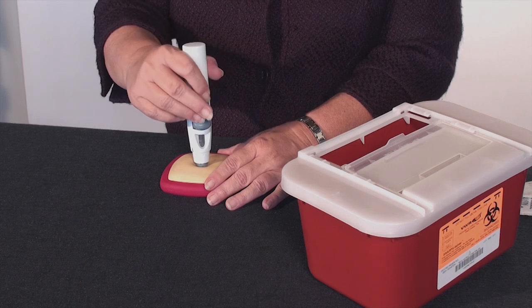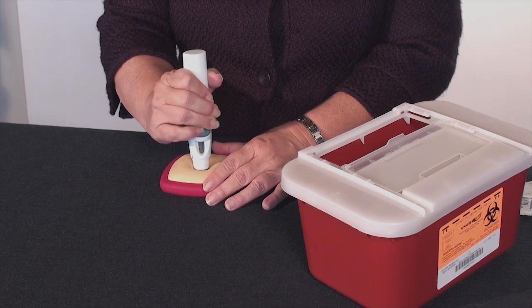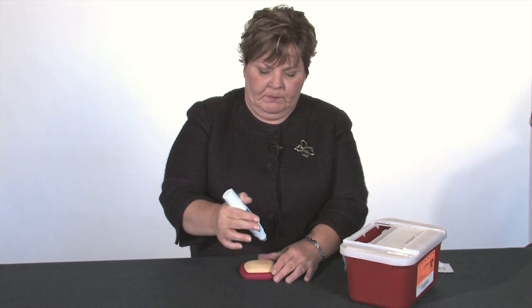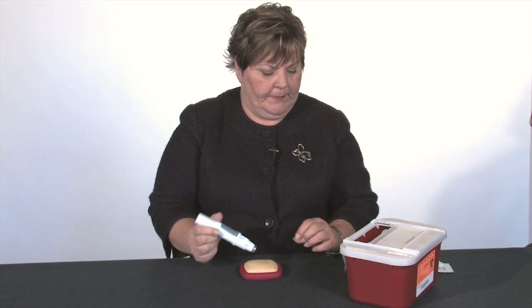Hold the device against the skin. You're going to hear a click. When you hear the second click, you're finished — the device is done. All it takes is a squeeze of this button, and that's how you inject Sympony.